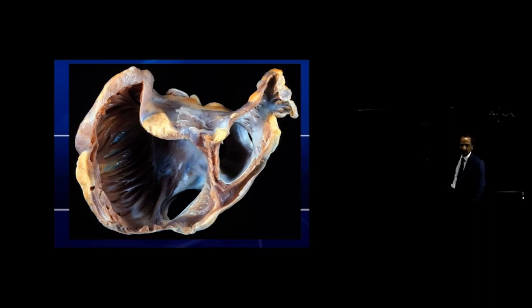Now contrast that with a couple of other scenarios. When we have free wall flutters and we're trying to anchor to the tricuspid valve, we do have an epicardial layer. And this epicardial layer can actually be seen to be continuous with the plane of the CS and the vestibule. So that becomes epicardial. And then we have thick muscle that you can trace into the appendage, and you have the pectinates that have come out of the appendage here.